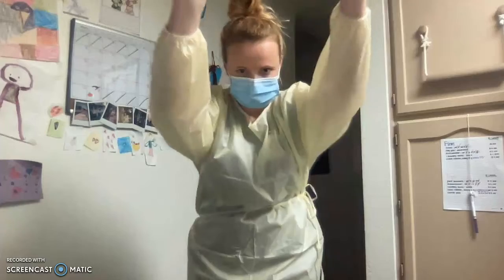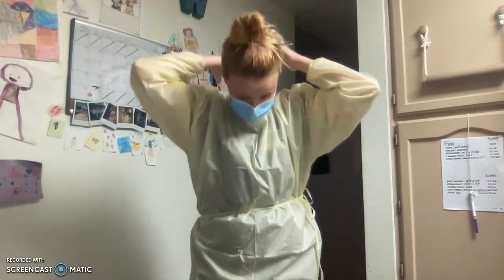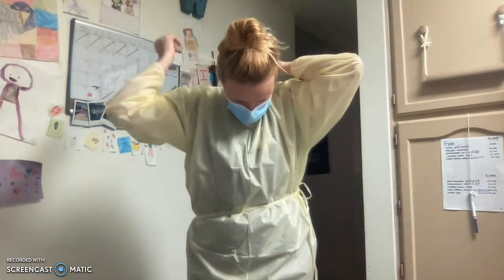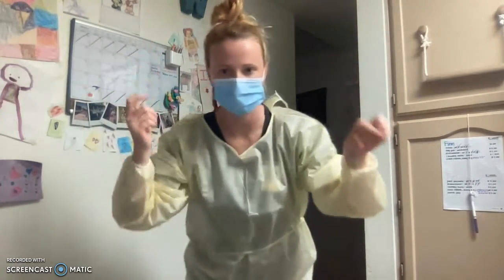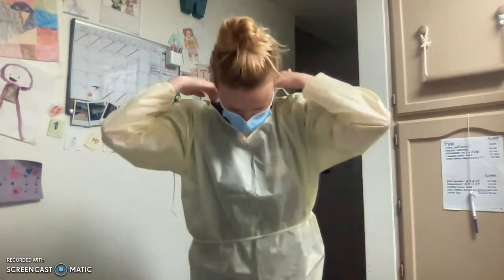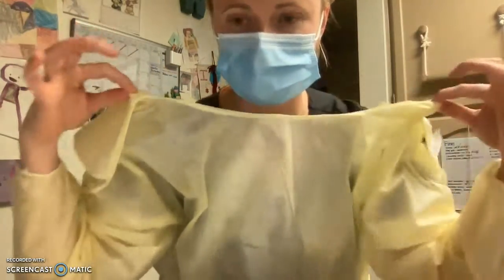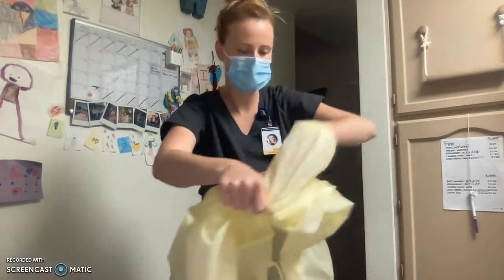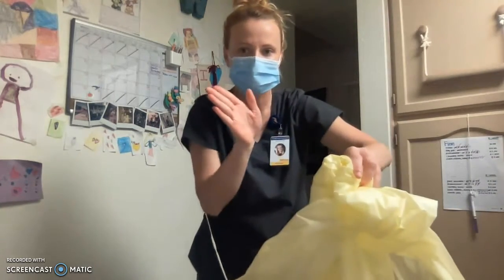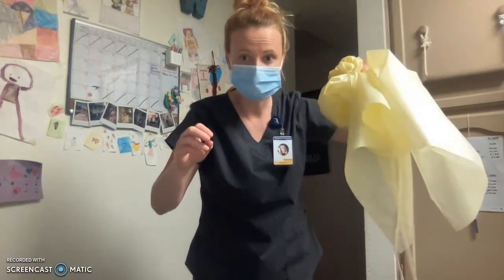Then pull the sleeves just slightly. Come around my neck here and untie the strap, ensuring that I do not touch myself with the gown, as it could be contaminated. Undo my waist strap. When pulling it down, I need to grab the inside of my gown. Pulling it downward, again grabbing on the inside. Rolling it up so that the outside is covered and folded inward. Dispose in the biohazard trash.